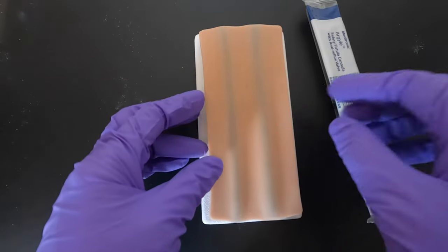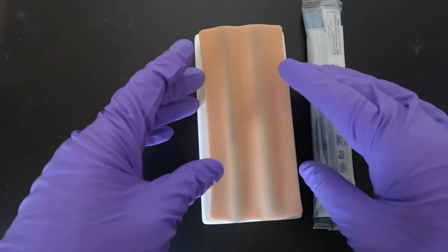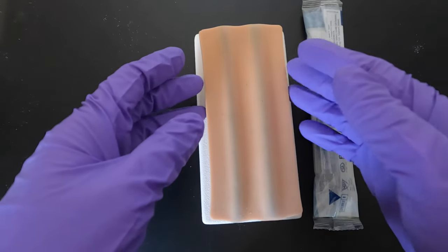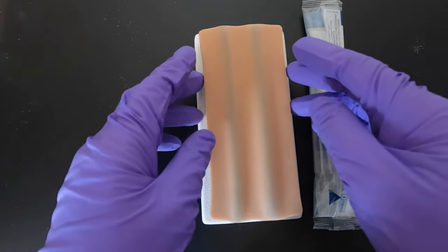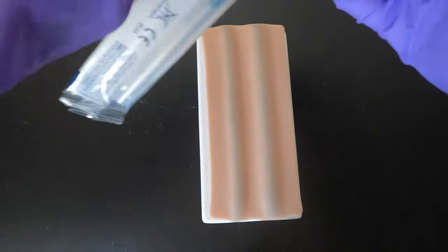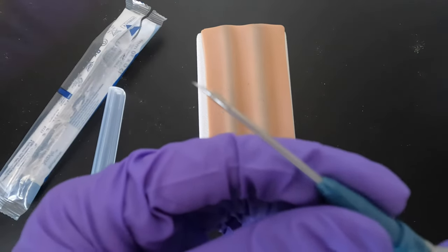Now I'll show you how to use this needle during cannulation. I'll go straight to the cannulation process. Different units have different ways of disinfecting and cannulation processes — some use sterile gloves with non-touch technique, and some just use the clean gloves process. It's up to your unit's protocol. You still need to apply a tourniquet, then just open the packaging and take out the cap.